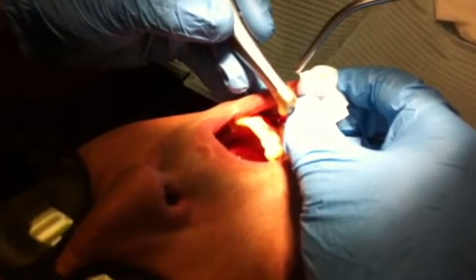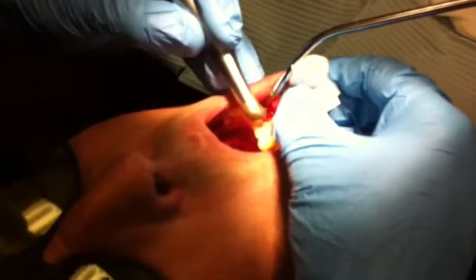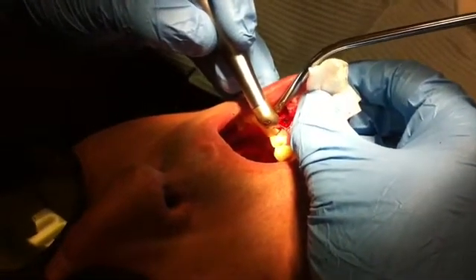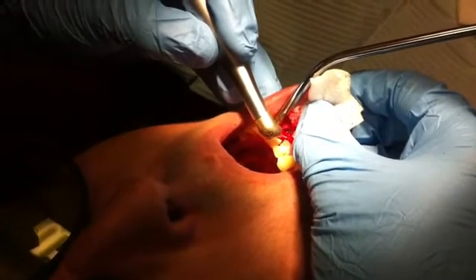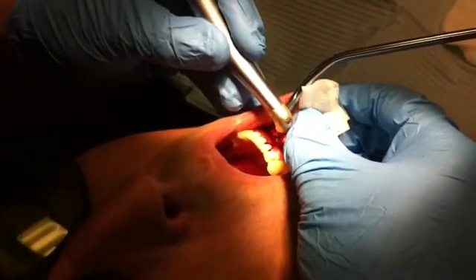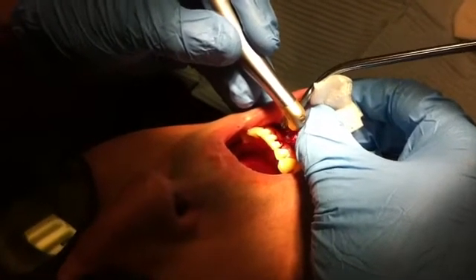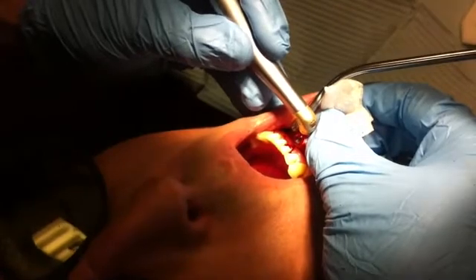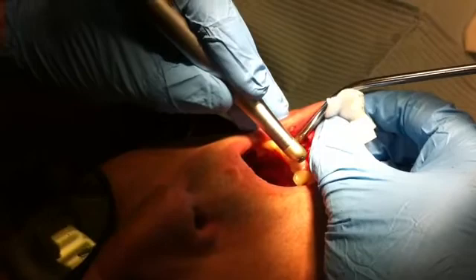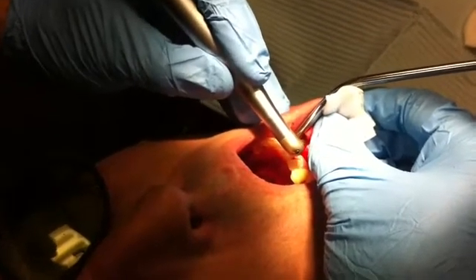And that goes like cauterization over there? Pretty much. You might even be able to use a little bit higher setting. See, it's turning white now? You're sterilizing right now. Really paint that thing white all the way around it. Good.